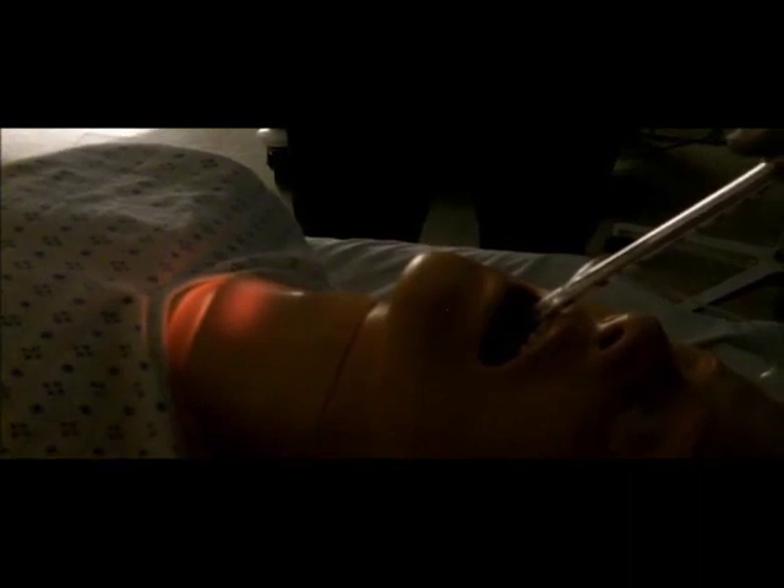Rock the device on the fulcrum created by the bend. Allow the distal end of the tube to traverse an imaginary arc and enter the glottis. When the tip of the endotracheal tube is in the glottic opening, a well-defined glow will be seen at the anterior neck just below the laryngeal prominence.